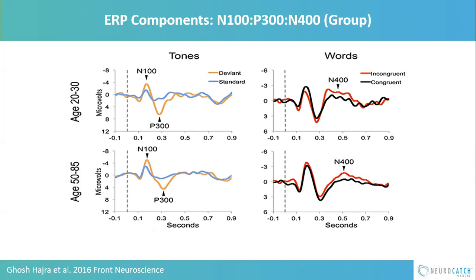So one of the interesting things that I taught you last time is that signal averaging averages the EEG noise to 0. And a way that you can check that is we actually start recording a little bit before the stimulus. It's called a pre-stimulus baseline.